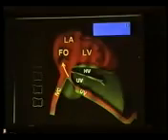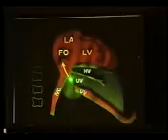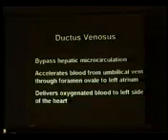So here is a picture. This is the umbilical vein, very easy to trace. Umbilical vein suddenly narrows, and we already described in the animation in the beginning that this sudden narrowing is deliberately done by nature, so that the blood coming from the umbilical vein produces a jet, so that all the oxygenated blood goes into the foramen ovale rather than splitting and going into the right ventricle. So this jet is very important, and that jet is ductus venosus.